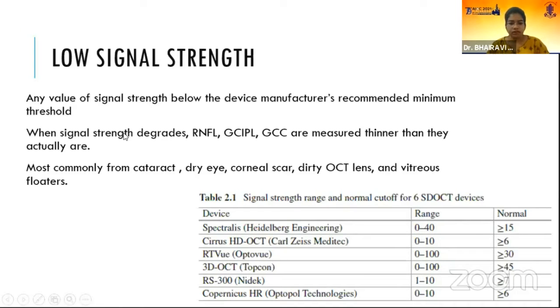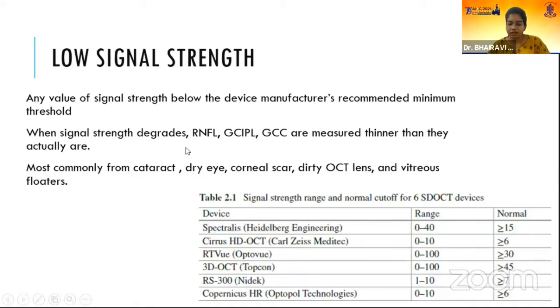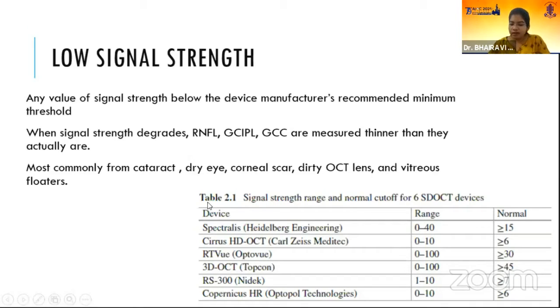Low signal strength is any value below the device manufacturer's recommended minimum threshold. When signal strength degrades, RNFL, GCIPL, and GCC are measured thinner than they actually are. It is most commonly seen due to cataract, dry eye, corneal scar, dirty OCT lens, or vitreous floaters.